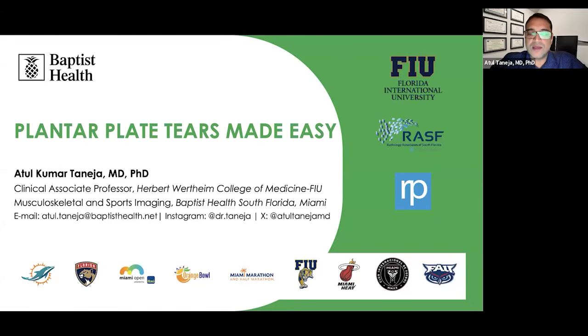Thank you, Majid, for the kind introduction, and also I thank the Society of Skeletal Radiology for the invitation to speak to the Resident Education Club. So for the next 40 minutes or so, we're going to talk about plantar plate tears. I'll try to make it easy. It's not an easy topic, like Majid just mentioned. It brings a lot of anatomy, and it demands our careful attention and dedicated protocols, so we can bring the best of our knowledge to the reports.